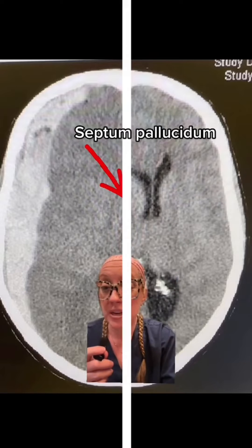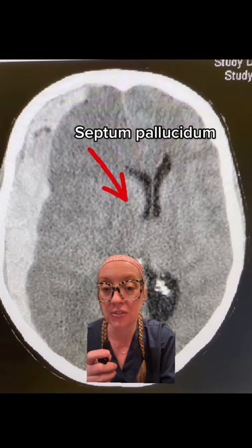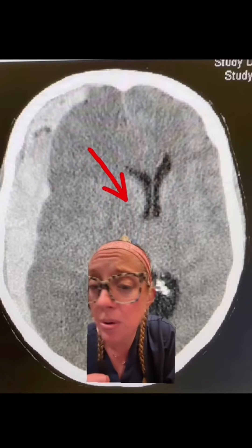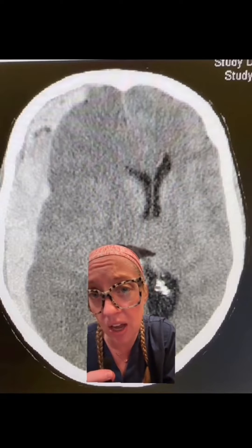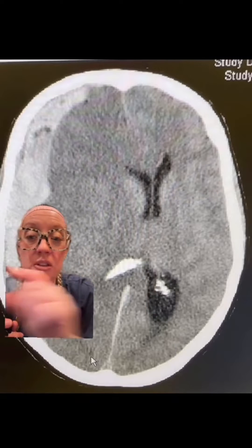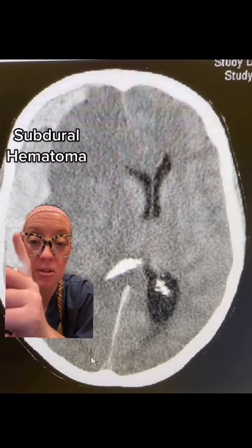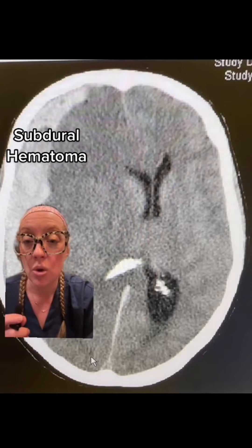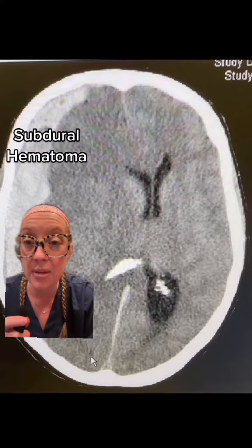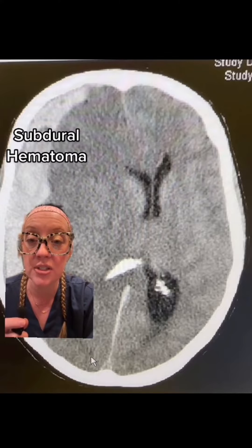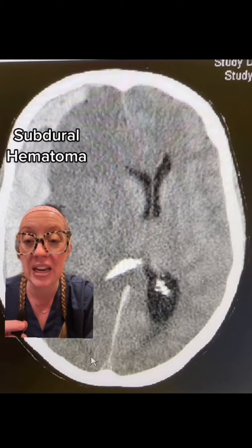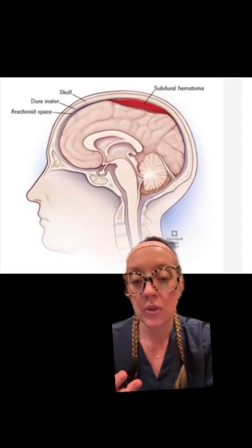So this patient has a large midline shift — basically, one part of the brain is shifted over to the other side. That's because of this large subdural hematoma, which is this white material on the scan, and it's bleeding between the brain and the skull.